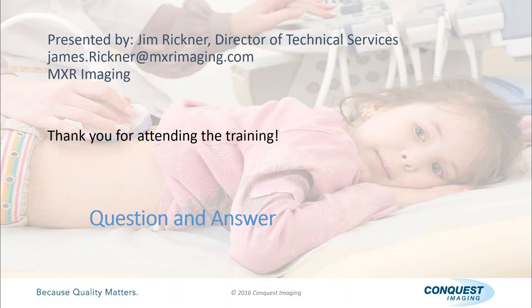Like I said, I have another short presentation to give you special instructions, but if you guys want to pass this around, just go around in the circle. Do you have any questions for me on this first portion of the presentation? Anything at all?